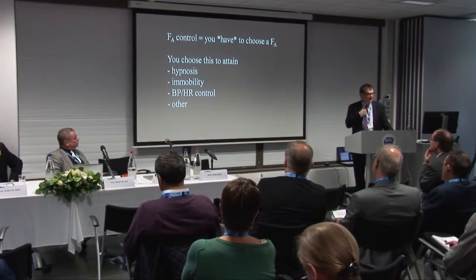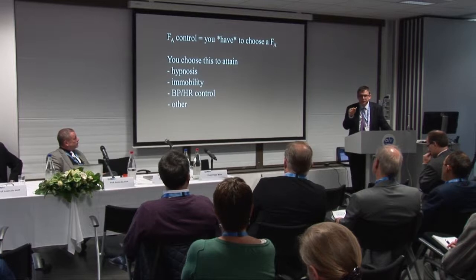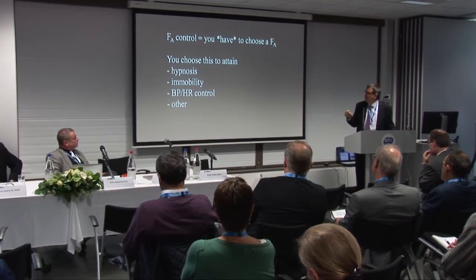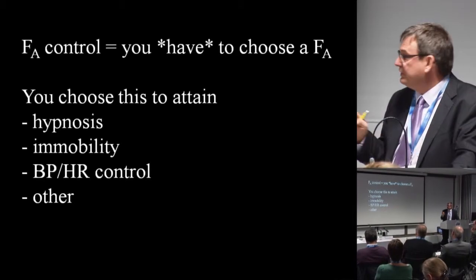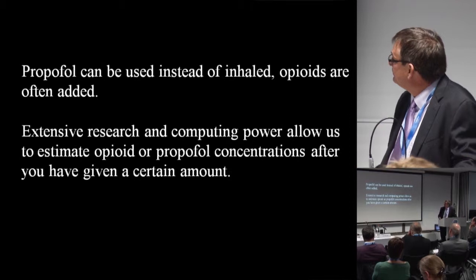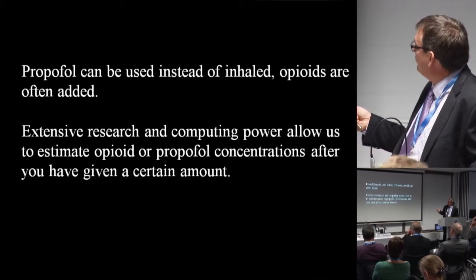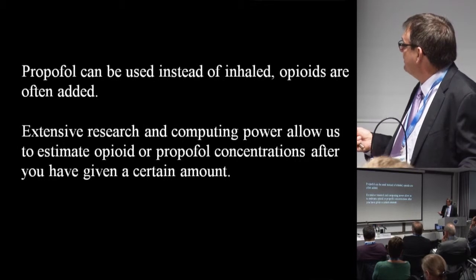Now, if we work with end-tidal control, we have to set the end-tidal concentration. You choose a certain end-tidal concentration to attain hypnosis, immobility, control of the heart rate and the blood pressure, and other clinical endpoints. We can use propofol instead of inhaled anesthetics, and we often add opioids.